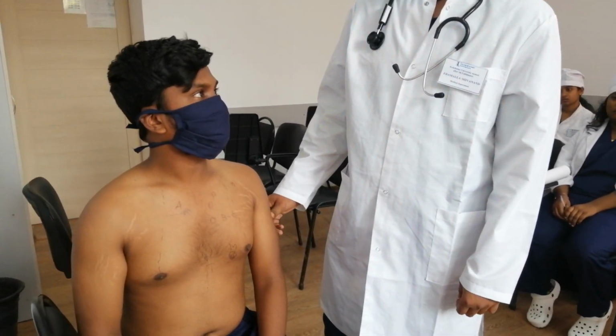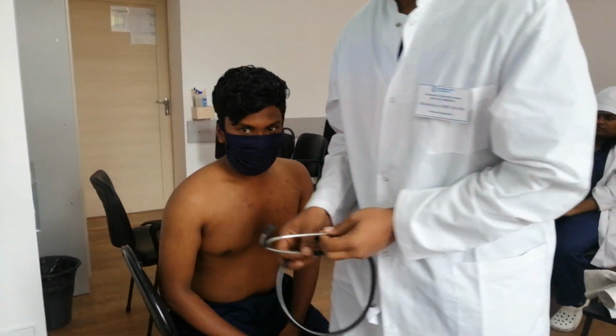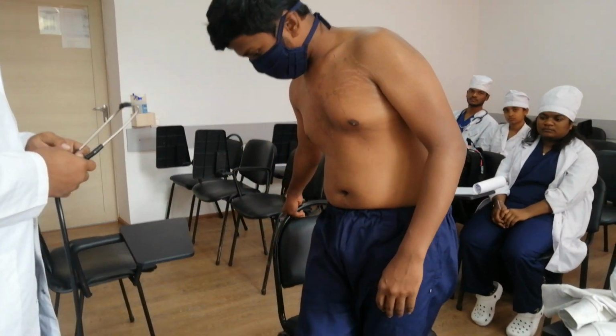Okay. What's your name? My name is Avaru Sai Sumit. Okay. Can I check your auscultation? Yes. Okay, standing on the right side of the patient. Please, you sit, change your chair. Okay.